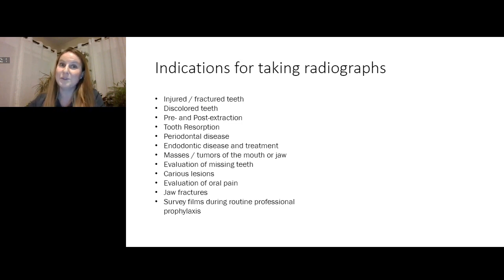And that includes when we have our patients on the table when they're first coming in and they're young and we're looking in the mouth and maybe we don't see those 4 premolars that should be in front of that big molar tooth on the bottom. If we don't count 4 premolars in front of that in our dog friends, we need to say, let's get some radiographs. And if you notice on your spay and neuter patients that first premolar tooth on the bottom is missing, you definitely want to take a radiograph of that, because it's not always that these teeth are actually missing. And if they are, that's fantastic.